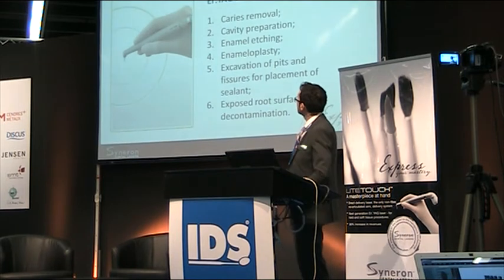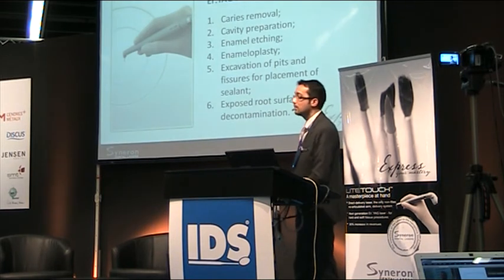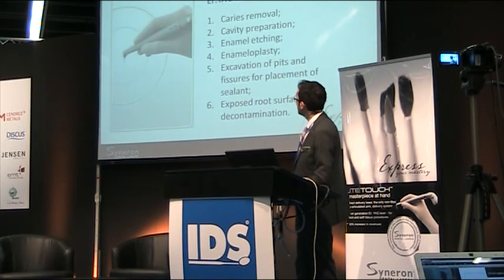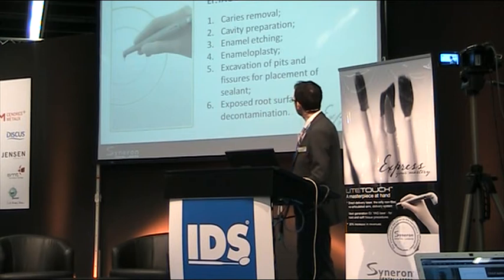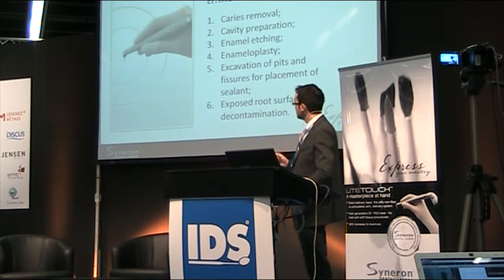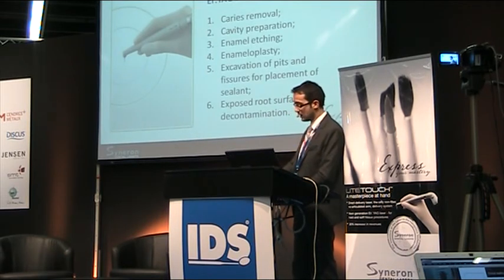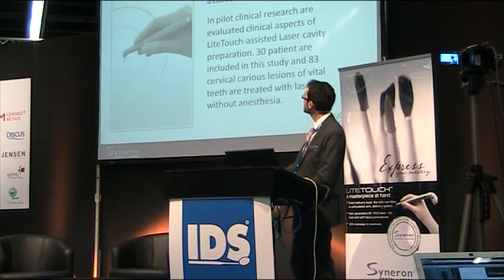So what are the clinical implications? For caries removal, for cavity preparation, enamel etching, enameloplasty, excavation of pits and fissures for placement of sealant, and to decontaminate the exposed root surface when we have any gingival recession.